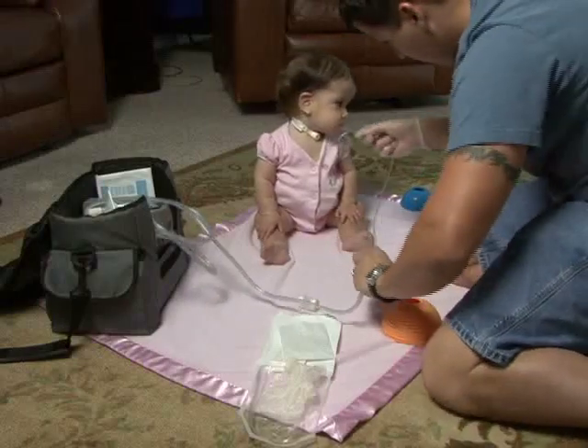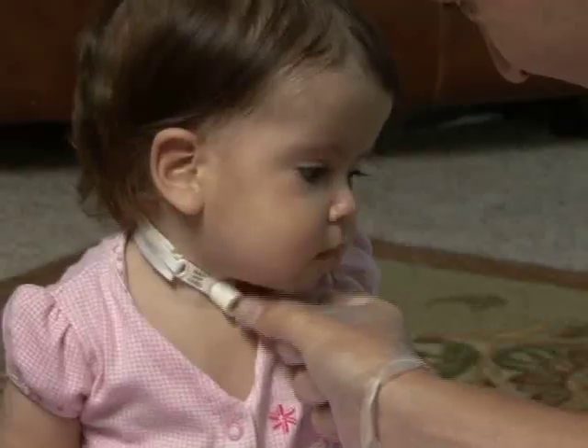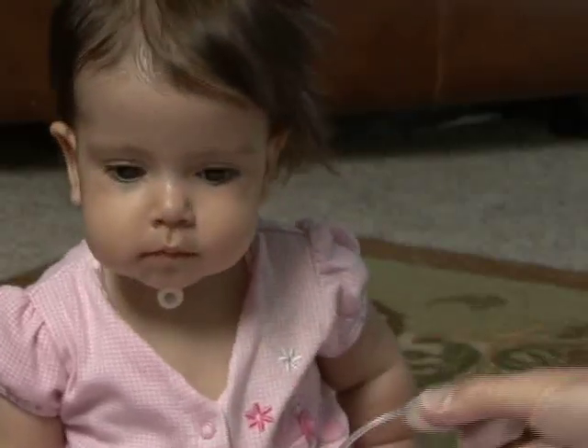So now you know how to suction. A common question after a tracheostomy is: how often will I need to suction? The answer that everyone gives — that you will just get to know your child — is actually very true. When the child is gurgly, suction. You will start to notice what is normal for your child. Maybe your child will only need suctioning a few times a day, or maybe more like seven to ten times a day like our daughter. If she is sick or it is an extra humid day, it is even more often.